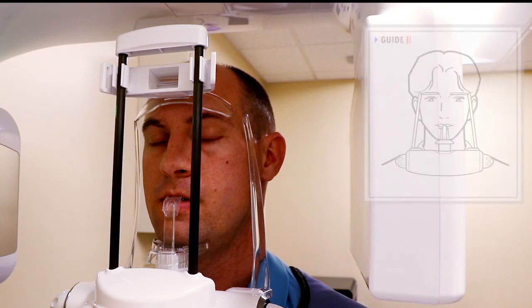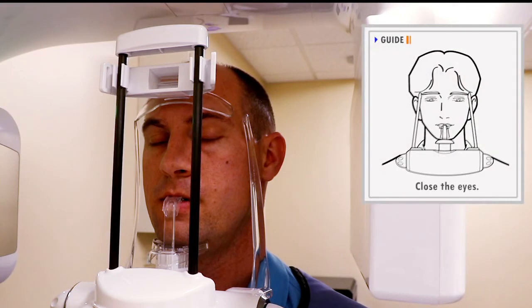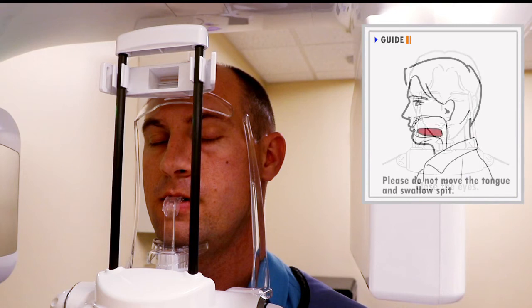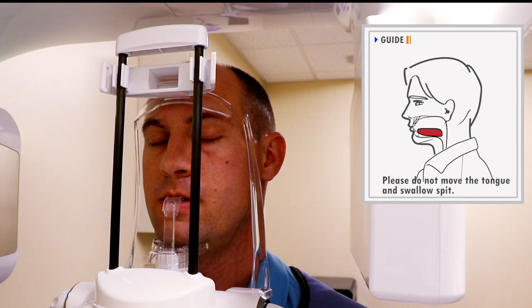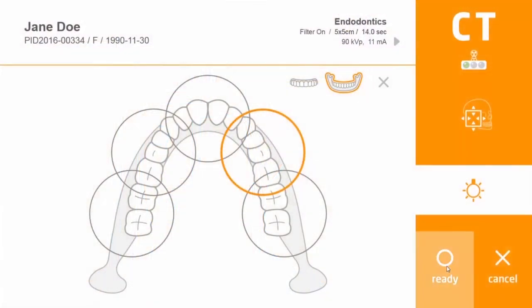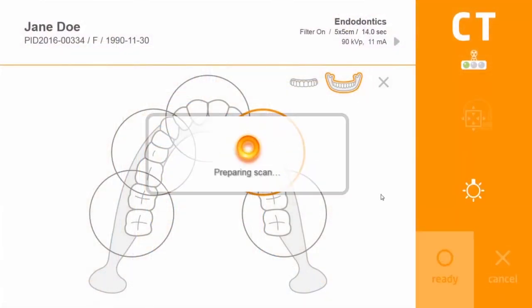Tighten the temple supports and instruct the patient to close their eyes. Also instruct the patient not to move the tongue until the image scanning is completed. Press Ready on the remote control, touch screen, or scanner program.